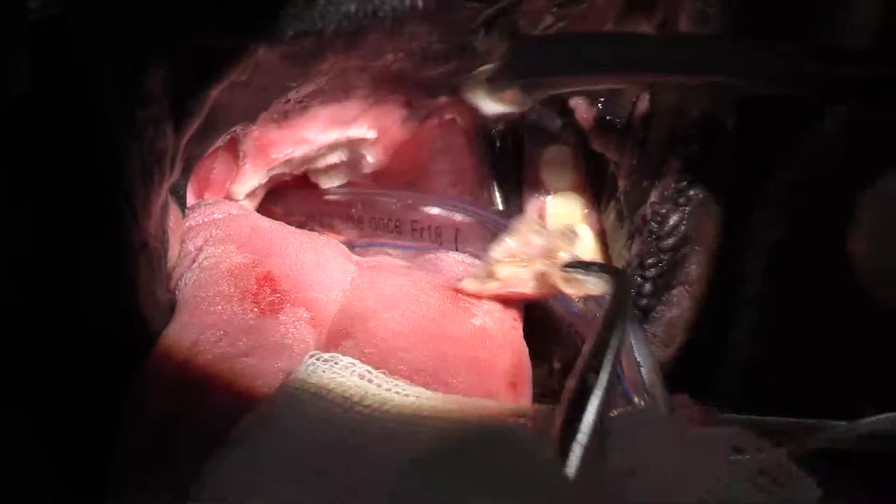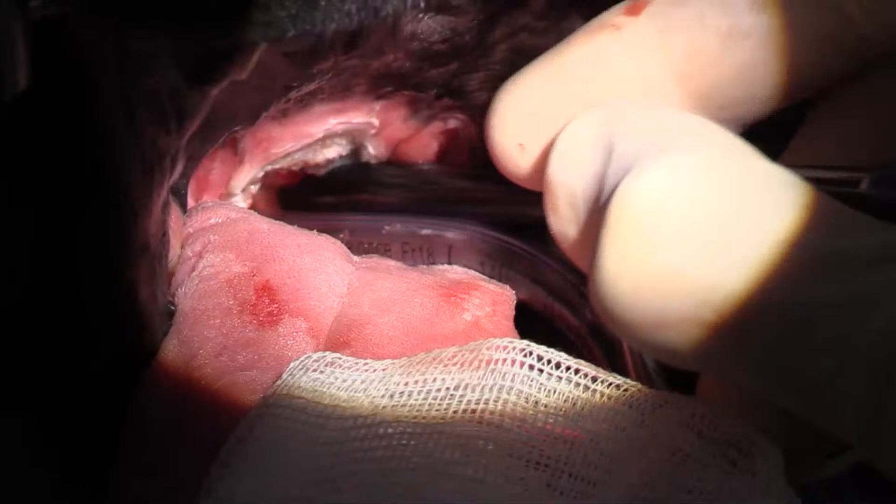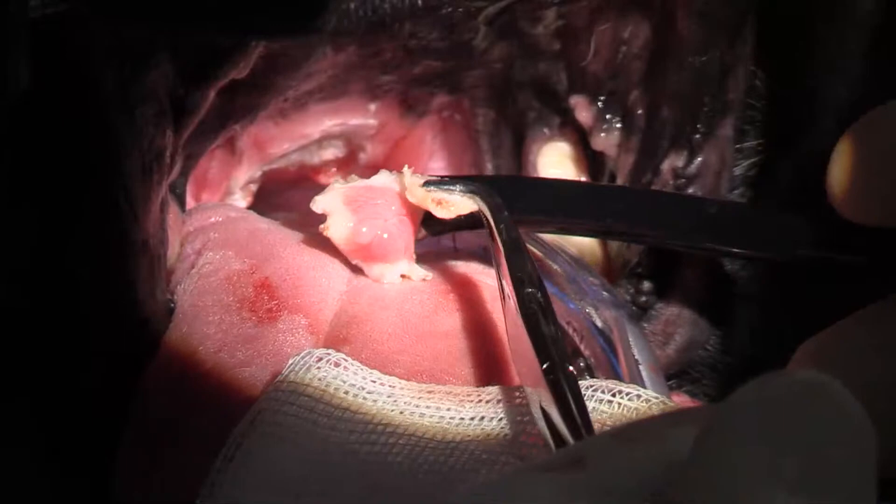That's what I've taken out — just the thickness. You can see the thickness of soft palate I've taken out there. Virtually no bleeding. I'm going to suture this up with some 4-0 PDS.